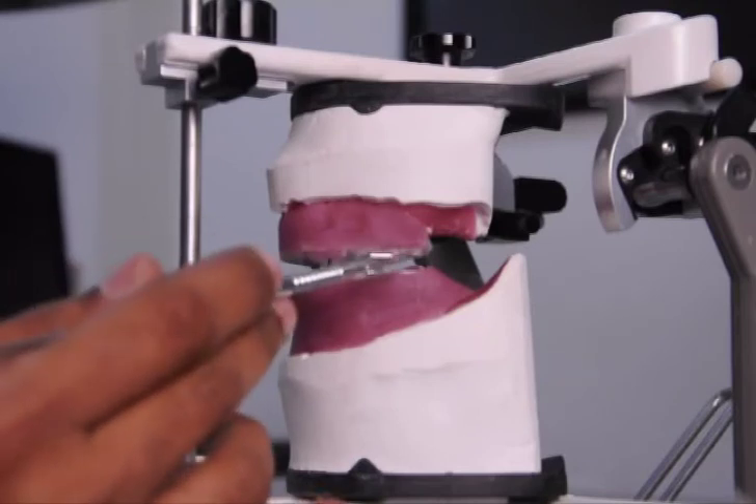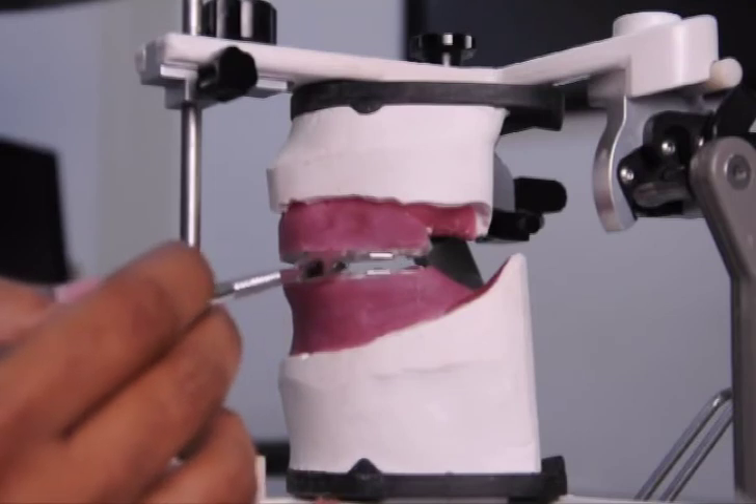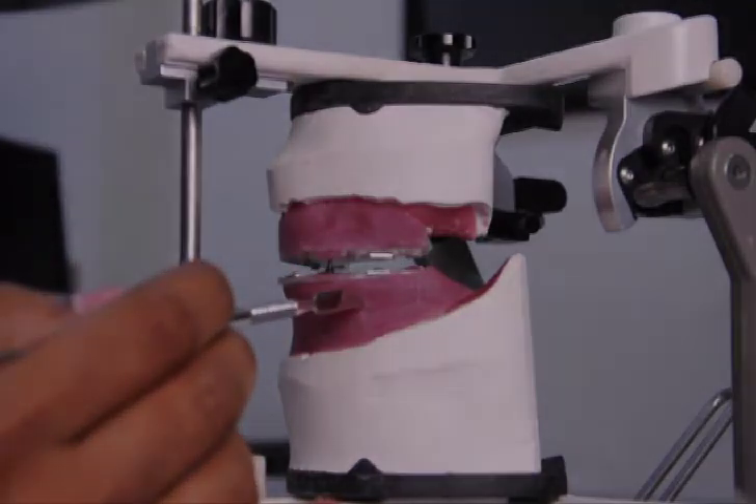And for the dentist to inject the bite registration material onto the space and record the upper and lower denture base relationship.